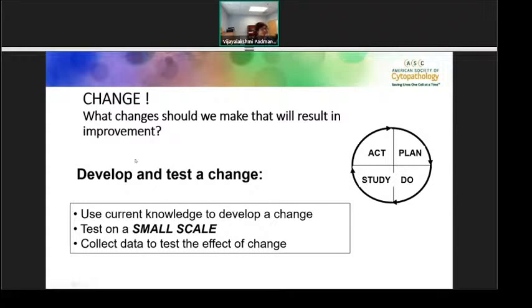So what changes should we make? After we got data with the second PDSA cycle, we decided that for every lung cancer case, we initially cut 20 slides, the first 13 for molecular testing, the rest for diagnostic work. And we actually exceeded our own expectations, and more than 90% of our cases were adequate for molecular testing.